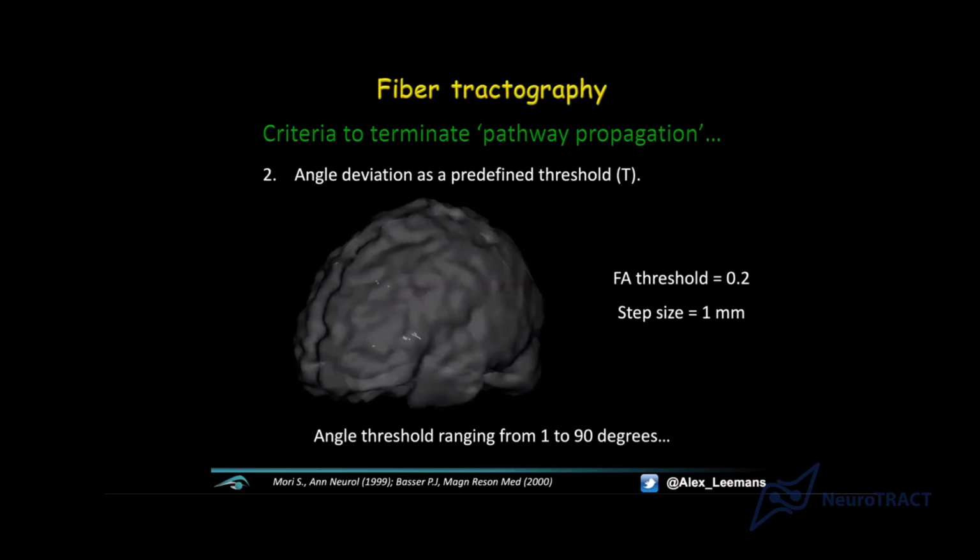What I'm going to do now is start the animation, and you can imagine that if I'm becoming more lenient towards accepting propagation of pathways with a higher threshold, you'll get more tracts and at least longer tracts. Okay, so let's start the animation. There you go. Every time frame is showcasing an increased angle threshold. And let me show the animation again, just because it's fun. You can actually see it growing, and it can be considered quite discontinuous. You have a pathway, and then maybe 50% of the pathway, and then at some point you get a big chunk added to it.